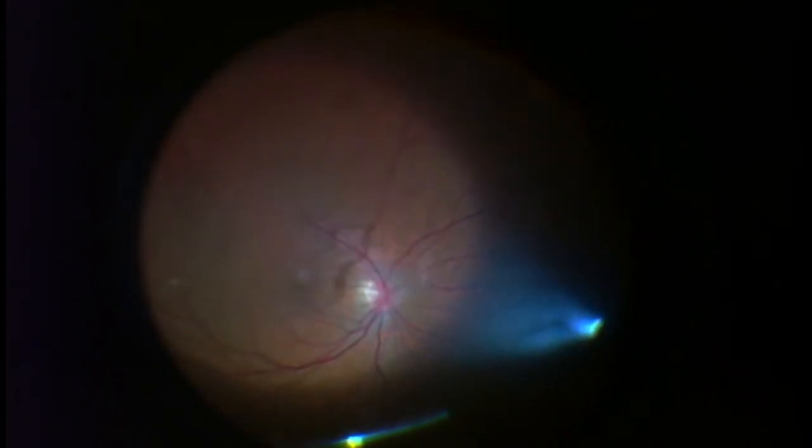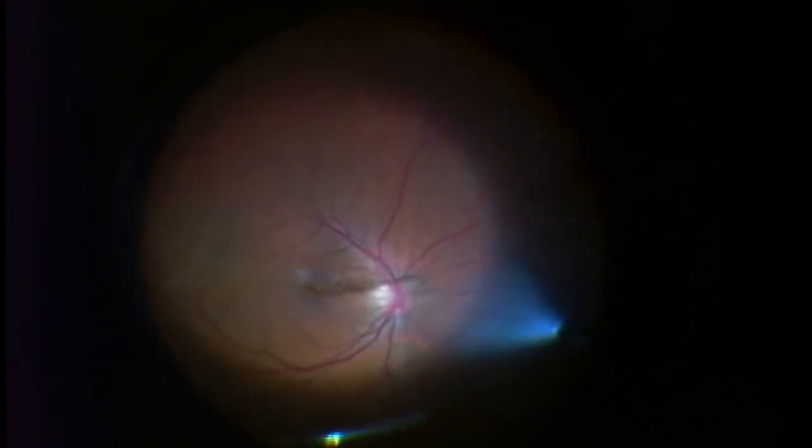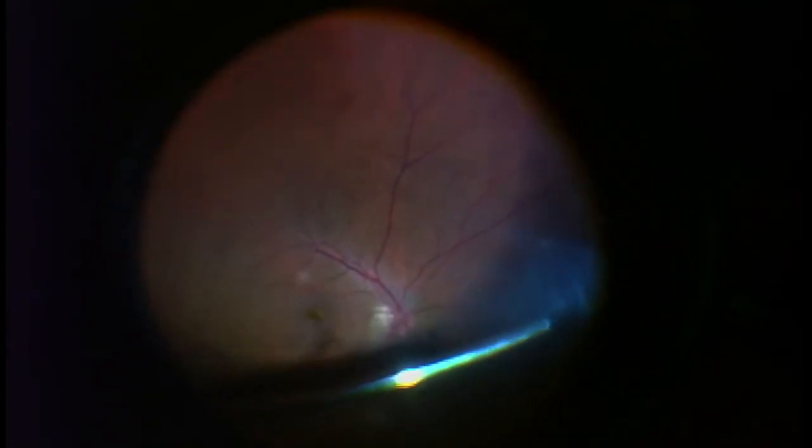This shadow clearly has some bearing on the large floater he's been complaining about. I first saw this patient about a year or year and a half before the actual surgery. The floater was so large that he could not tell me whether or not it was moving in and out of his vision, because I think it was always obscuring his vision.